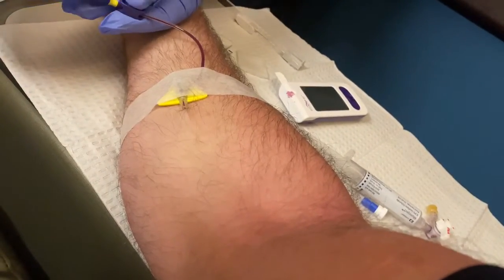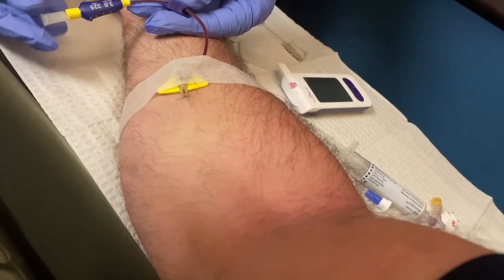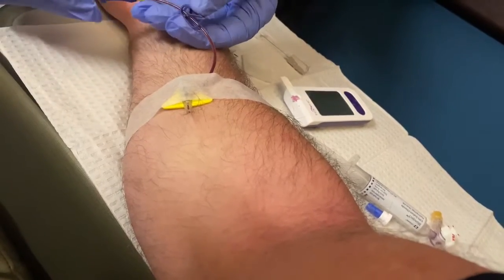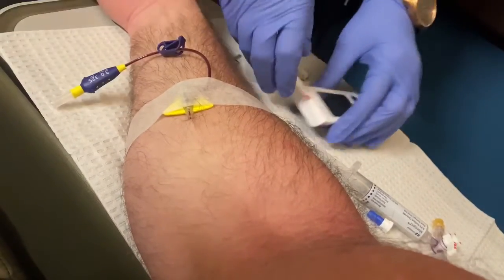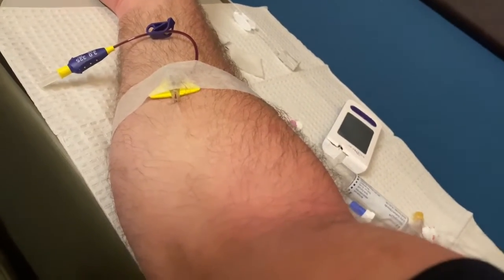I love this trick of how they can check my blood sugar. Except it's not going all the way through. Oh, it didn't. I might have to poke you. No problem. Usually this will fill up with blood. It's a small needle, so... That's why. So yeah, I'm going to have to poke you. Sorry. My blood was thick today or something. Yeah, all the way to the end.